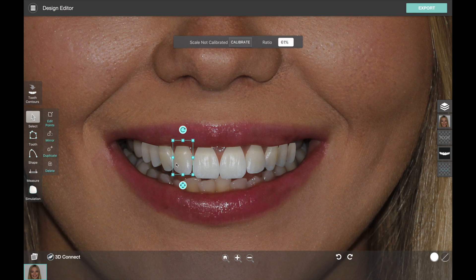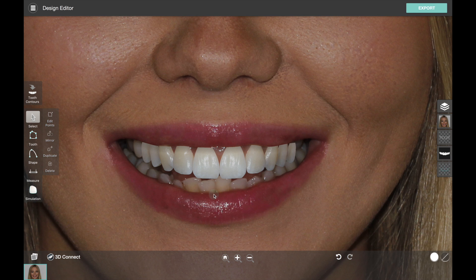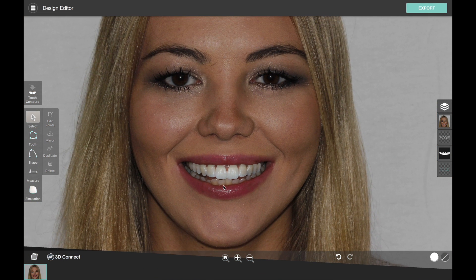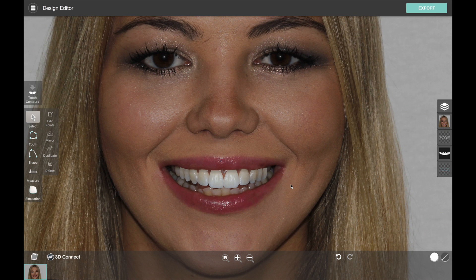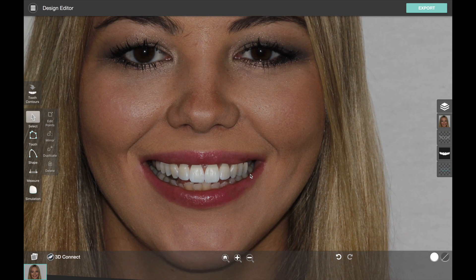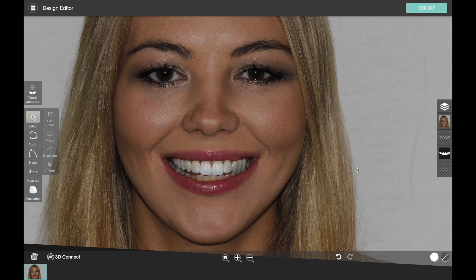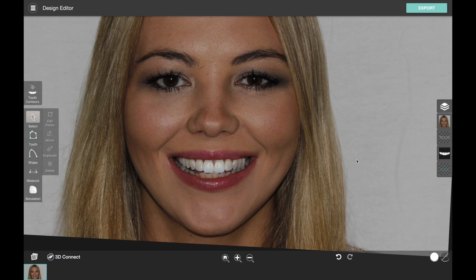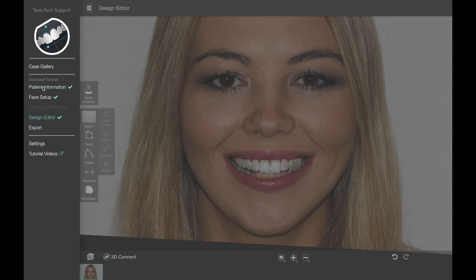Less is more with the smudge tool — you can really mess things up, but that's why you have undo and redo. Basically that's a good way to get the patient's existing teeth out of the way so you can really see the simulation. If I go back to the select tool, the teeth are still selectable and I can still make adjustments. This is really useful when you're sitting with the patient — if they're looking at the simulation you can say maybe these centrals are too long or too short, and you can make this a very interactive process. It's fully editable, not just a before-and-after baked into a picture. You can toggle the simulation layer off and on to show a before-and-after.